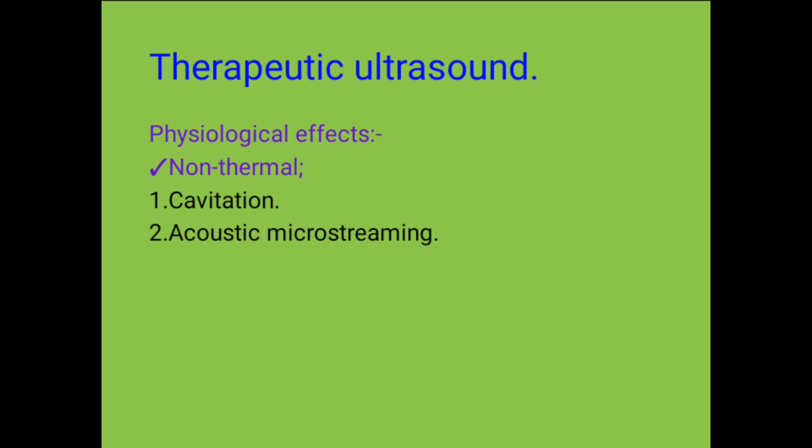First of all, we have cavitation. And what is cavitation? Cavitation is the formation of microbubbles on tissues or on the surface of a tissue when you are using therapeutic ultrasound. That's why when you are using therapeutic ultrasound, remember you will be required to apply a coupling media.